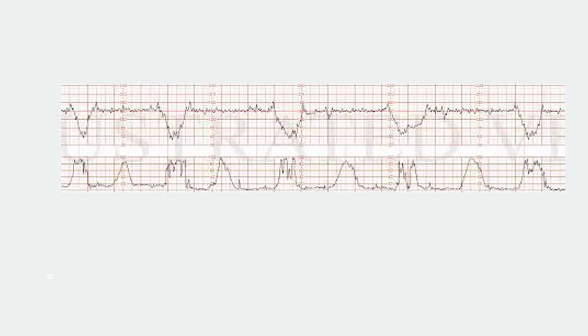And it's not really unusual for the baby to have decels with pushing because it's getting squeezed. The cord, everything else, it's getting squished in there. And as long as it's coming back up in between, we're okay. You can keep going. If you're losing variability and these are getting wider and deeper and longer to recover, then we're a little bit more concerned.